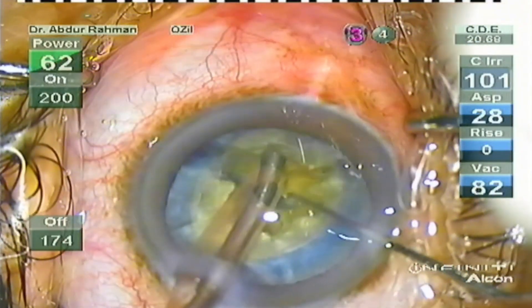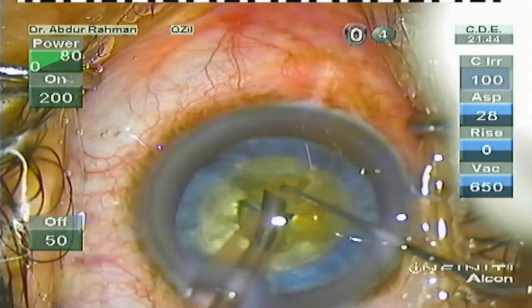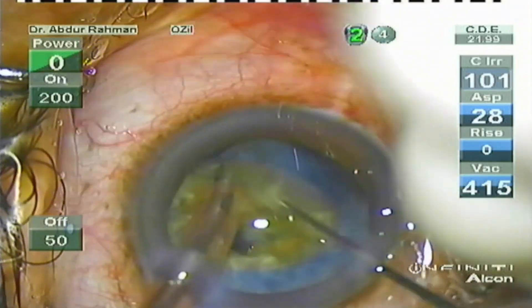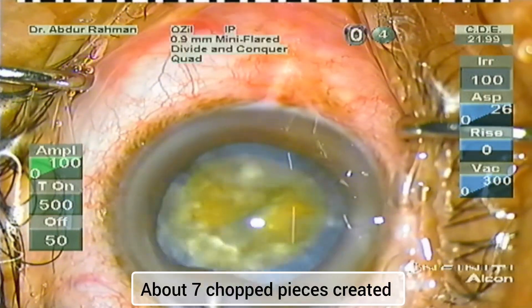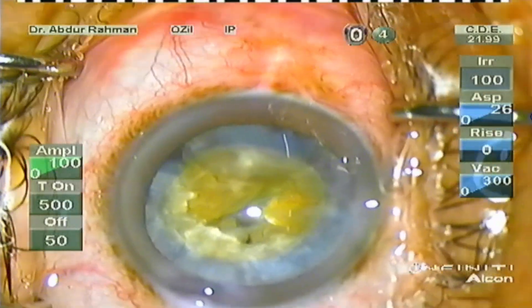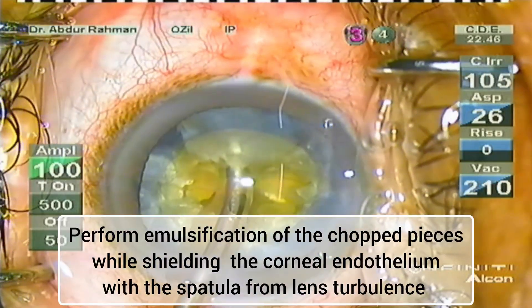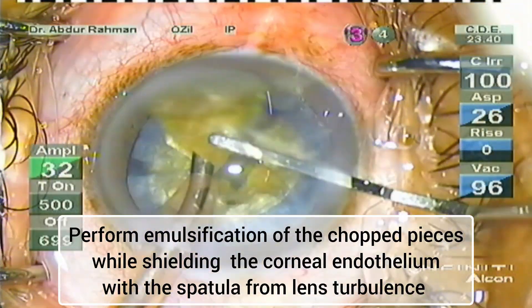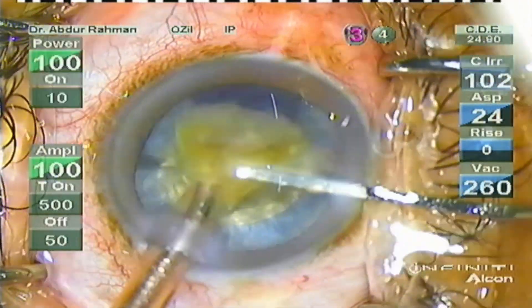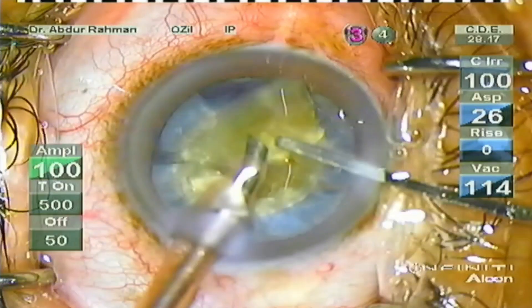Multiple chops are being performed here — about seven chop pieces I have created. I refill the anterior chamber with OVD to protect the endothelium during phaco emulsification. Now I perform phaco emulsification of the chop pieces while the spatula is shielding the corneal endothelium from lens turbulence.